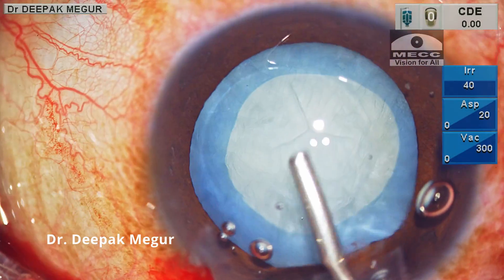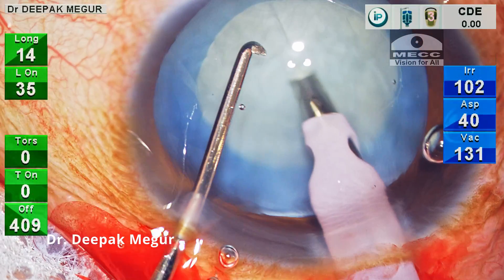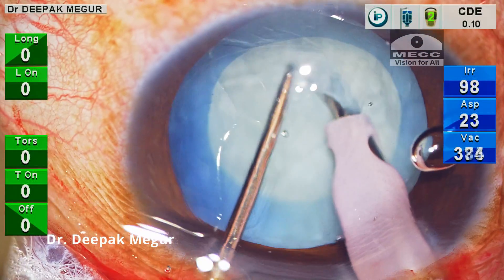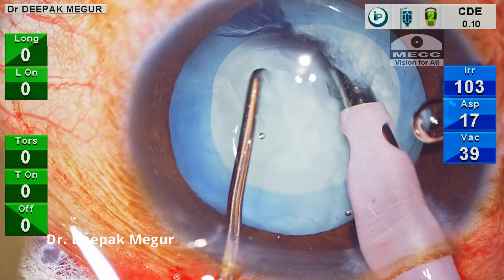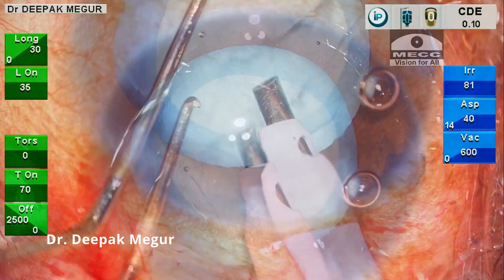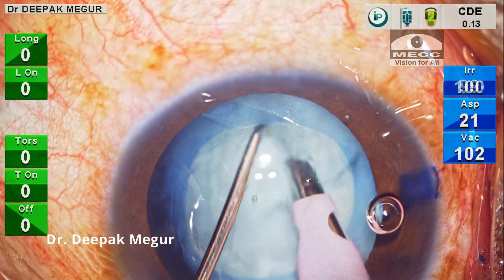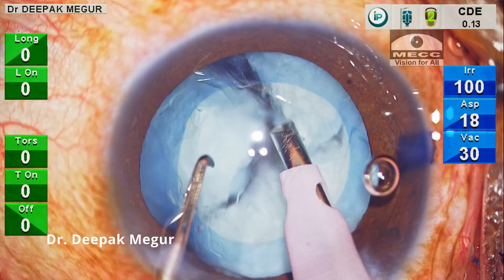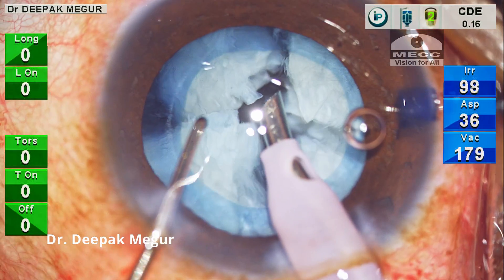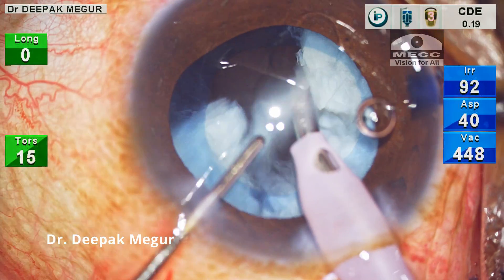Now is the time to phaco, which is ironically the easiest part in such cases. The nucleus is very soft and using very low power, I perform vertical chop. Since the nucleus is soft, I don't have to bury deeply — just hold it and the nucleus splits quite easily. Since it's soft and small, I made only four pieces, and using judicious low energy, the fragments are consumed at the pupillary plane.